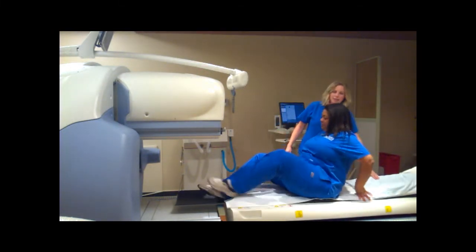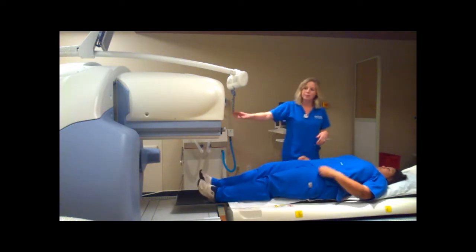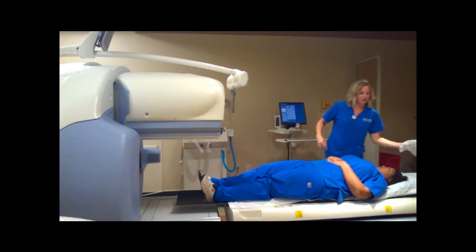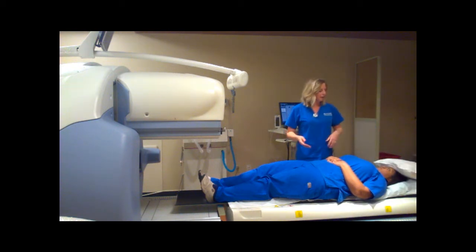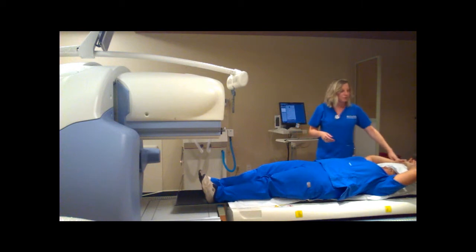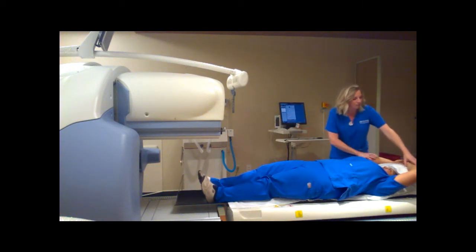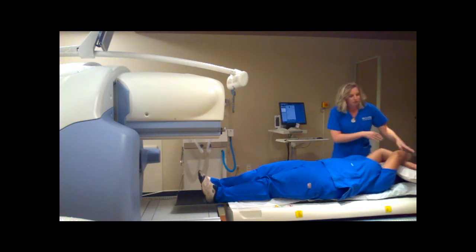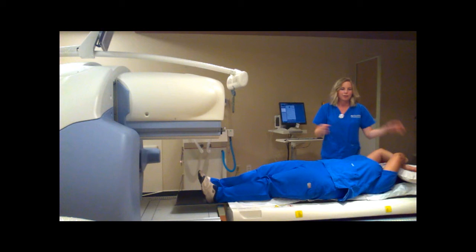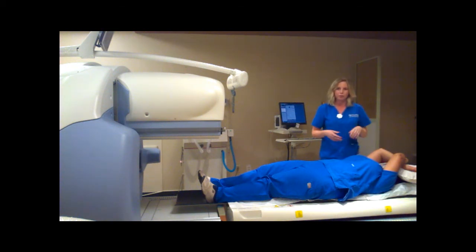Notice I laid the pillows sideways. That way they won't stick out off the ends and there's no chance of them being beneath the camera heads while they're rotating. Since we're going to be looking at her abdomen area, I'll put her arms up over her head. What's really important is that the arms need to be in very tight, because once we get to the CT portion, the camera heads are going to spin pretty fast and I don't want any chance of them hitting Tracy or her elbows.